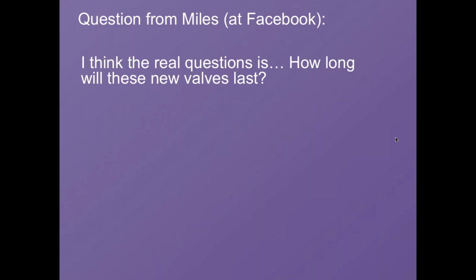So that's an outstanding question. I'm going to answer it in several ways. The cow valve that's being used, at least the valve itself, is very similar to the surgical valves. However, it is being mounted on a stent rather than a surgical ring. And so what we've tried to do is understand what the durability is.